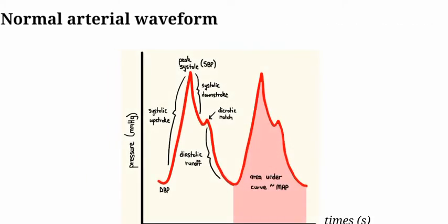The arterial waveform represents the cardiac cycle. The waveform starts with a sharp rise known as the ascending limb or anacrotic rise. This represents the rapid ejection of blood into the aorta following the opening of the aortic valve. The peak on this rise represents maximum ventricular pressure called peak systolic pressure. This is followed by a downward slope known as the dicrotic limb or descending limb, which represents the decline in pressure during diastole. The dicrotic notch represents the closure of the aortic valve.